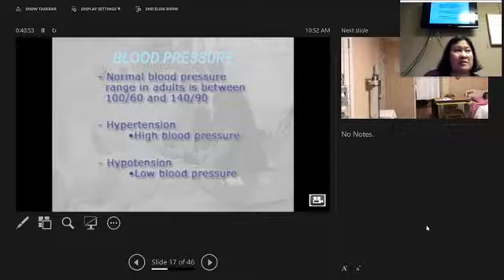Nobody's blood pressure should be above 180 on the top number, okay? So 140 is the maximum. It says to pump it up 30 above where you heard the last. Now, people do have blood pressures higher than 140, but for class, you should all have your blood pressures normal. If not, you need to be on medicine before national testing. But if 140 is the top of normal, then we pump it between 160 and 180, then start to let it go down in increments of 2, and you should hear it.